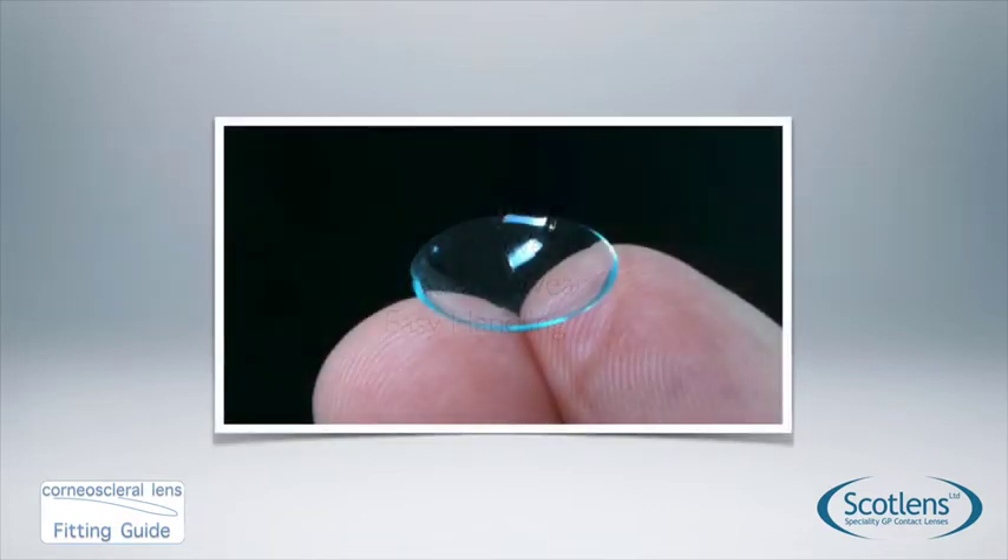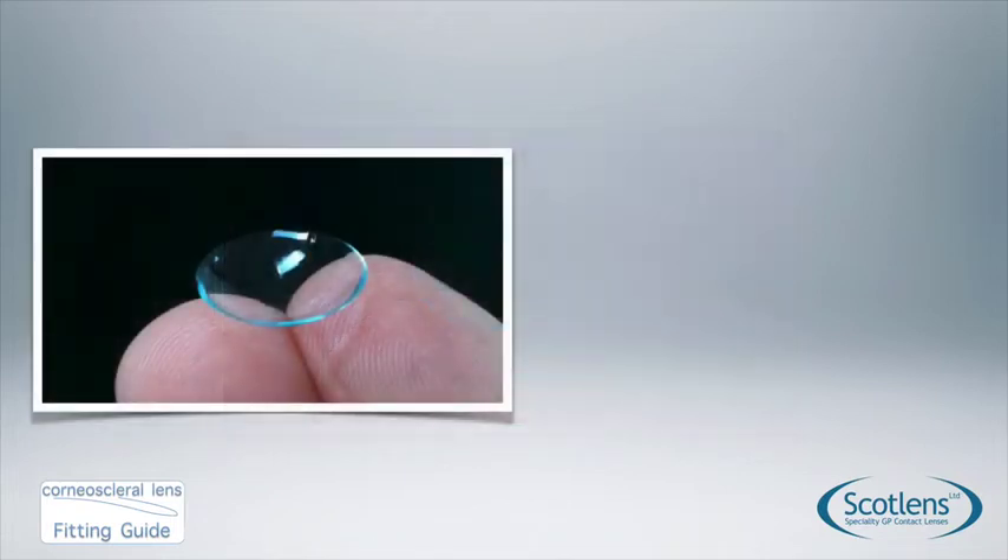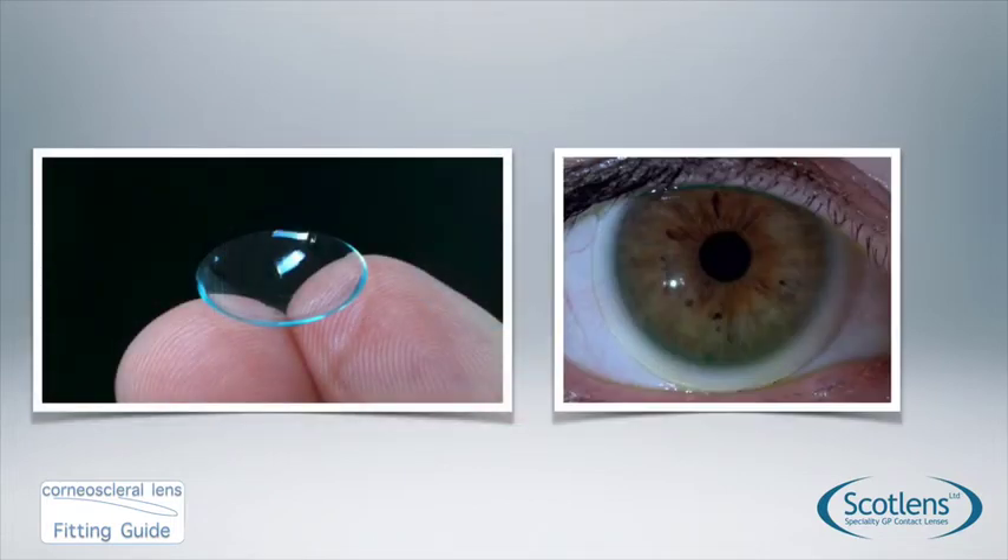This is what the lens looks like. You can see it looks very much like a soft contact lens but it's made out of a gas perm material. When we place it on the eye it also looks very much like a soft contact lens, with the edge of the lens clearing the limbus and being visible just on the edge of the border of the sclera.